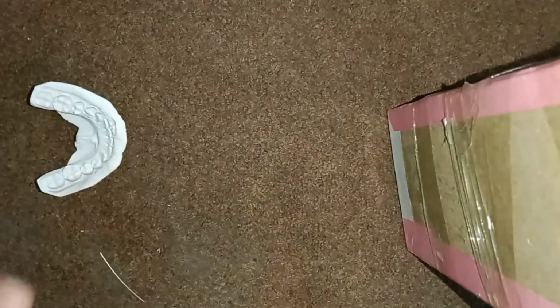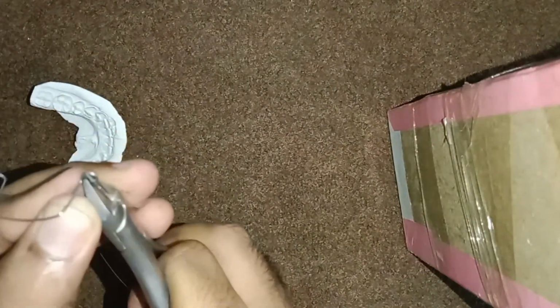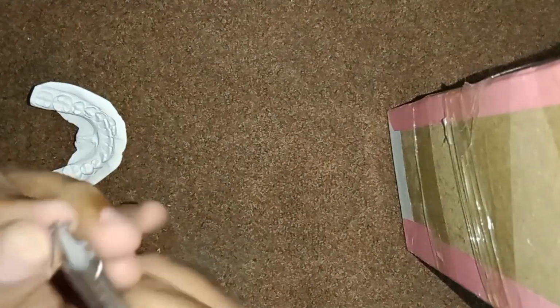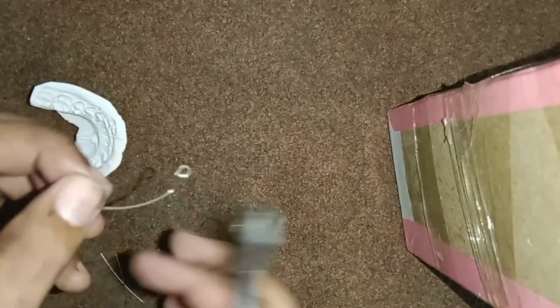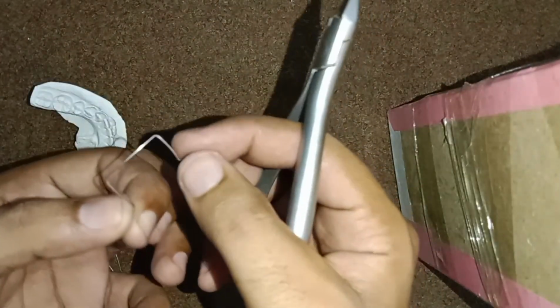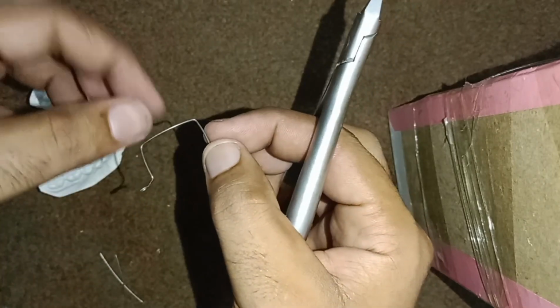Then we will make a loop at the end of the wire. This is the anterior piece of a 3-piece arch.